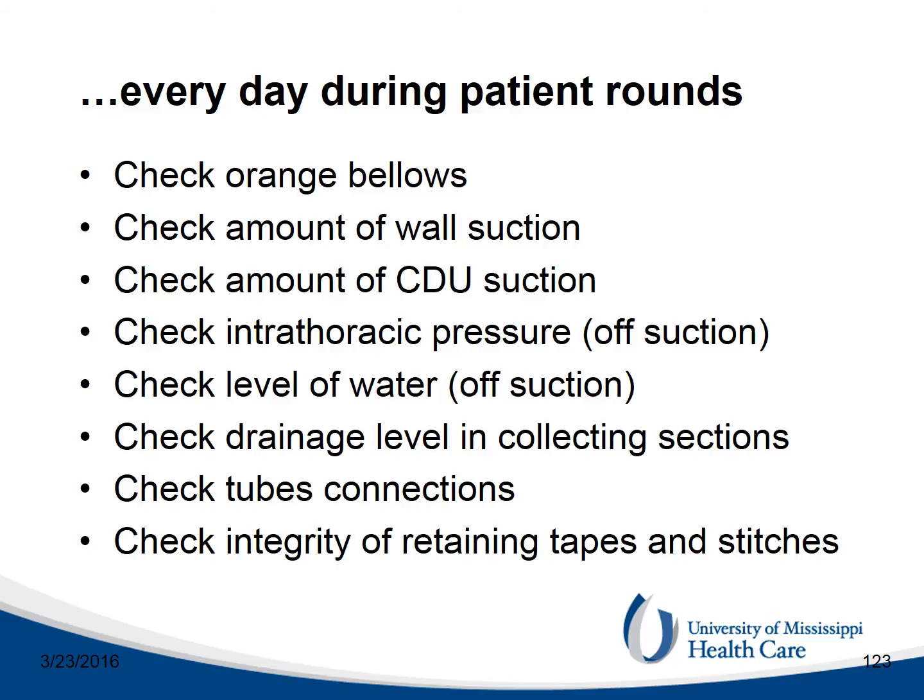Every morning during patients' rounds, it is important to check the orange bellows, check the amount of wall suction, check the amount of CDU suction, check the intrathoracic pressure when the system is off suction, check the level of water in the water-sealed chamber when the system is off suction, check the drainage level in the collecting sections, check the tube connections, and check the integrity of the retaining tapes and stitches.